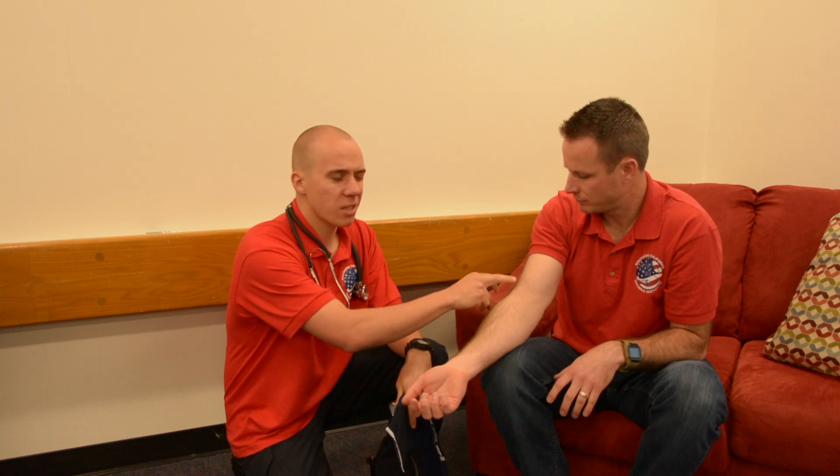Before placing the cuff, look to see if there are any scars, dialysis shunts, surgeries, or anything unusual going on with their arm. You don't want to put a blood pressure cuff on an arm that could be harmed if you pump it up. So look at it, ask them, and definitely do not place the cuff on an arm with a dialysis shunt.